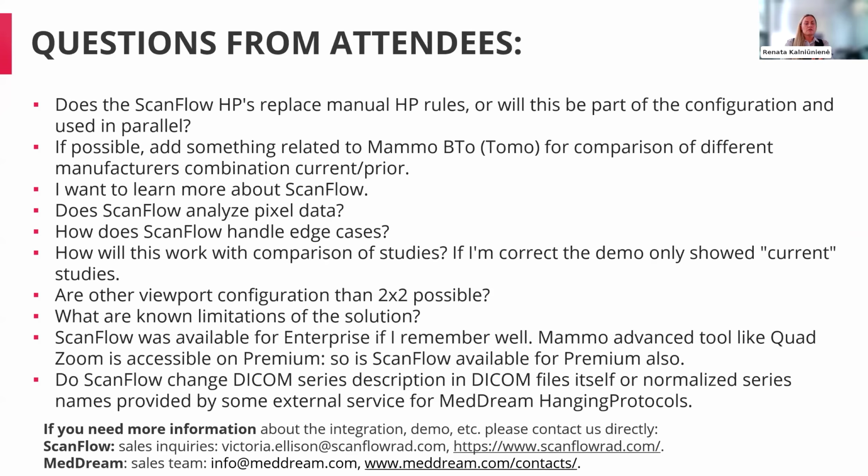The last one. Does ScanFlow change the DICOM series description in DICOM files itself, or normalize series names provided by some external service for MedDream hanging protocols? This is another great question. We do not change any DICOM series descriptions. We keep everything the way it is. We just organize it better, and we are able to recognize that this inconsistent label sequence matches the sequence that it's supposed to be, and then we can have a consistent hanging protocol.